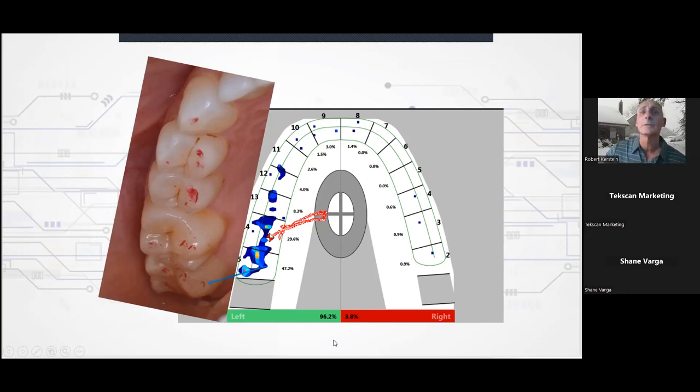But if you look at each of the arrows, you'll see they point you to the right paper mark that corresponds. And the thing about looking at this, the reason I selected this example is because this is the lingual border of the force zones. That's down here on the teeth, right? But it's not here on the T-scan data. It's not all the way to the lingual, right? This is the lingual limit of the force application to the teeth. So that's going to be this area. And the buccal aspect to the force delivery to the teeth is this area. And you see how that matches to these using the color coding.